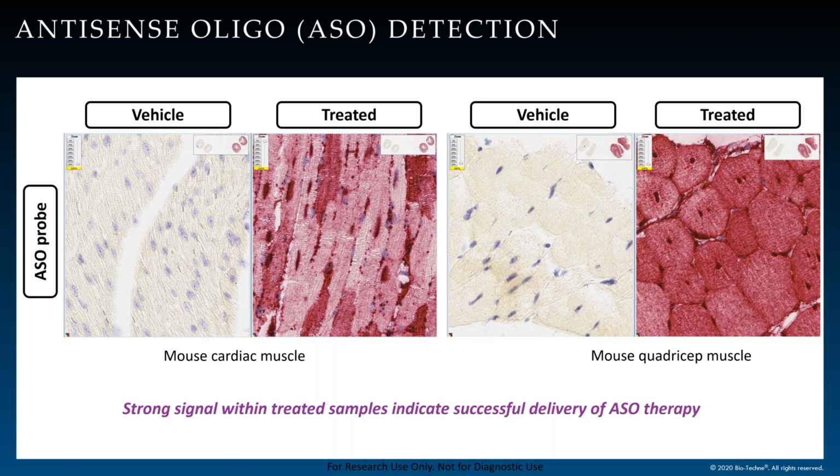This data allows you to formulate further hypotheses on how you can improve antisense oligo delivery by adding modifications, conjugating the ASO to be delivered to a particular tissue of interest. You can also study biodistribution as it is expressed in a particular tissue, or if it is more systemically delivered into the different tissues within the animal.